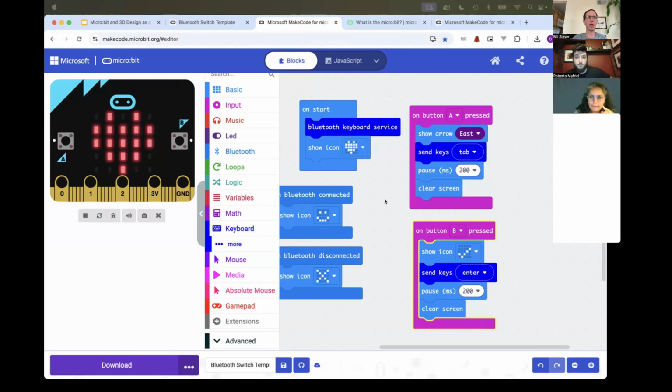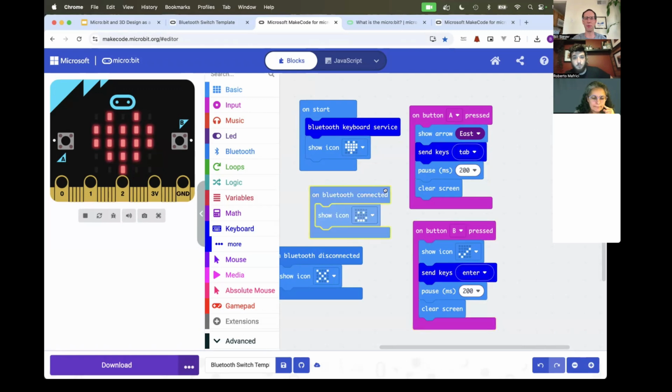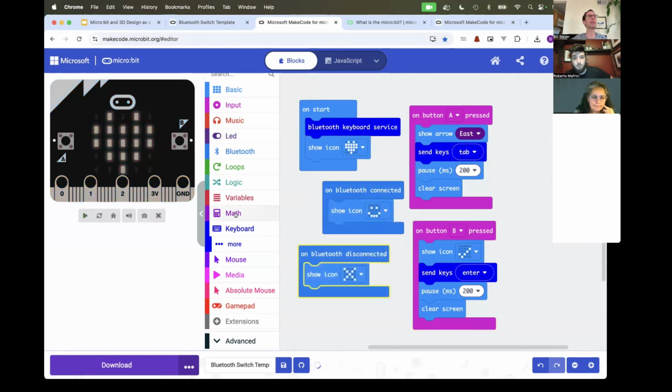There are other Arduino-like things that can support Bluetooth, so it's not your only option. It just happens to be convenient because the block-based editor here makes it really easy for almost anyone to create and edit these programs. Yes, even noobs like me. The idea is to encourage more people to be able to do this.